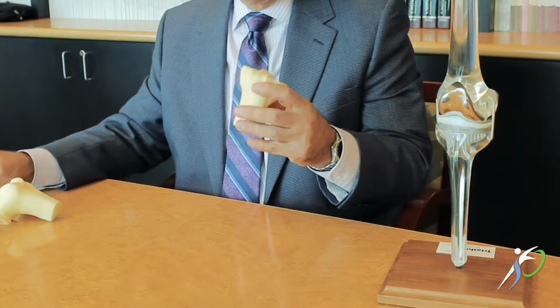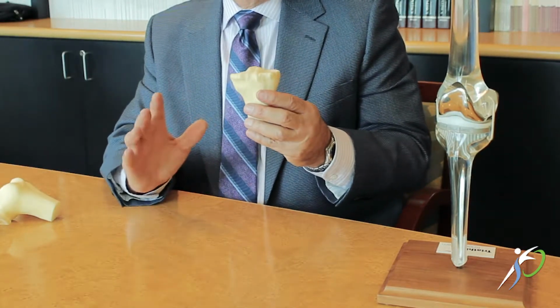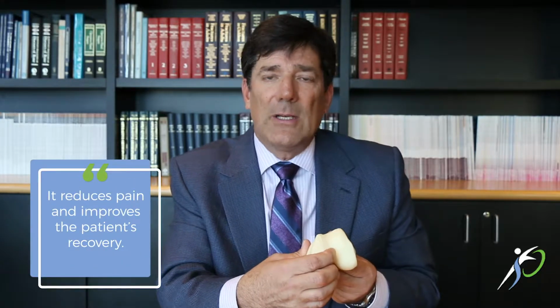By making these cuts very straight, it takes out all of the guesstimate that's done at the time of surgery when we do these manually, and the results are that the cuts are perfect. And in terms of the femur, we don't have to drill a hole in the bone to line up the bone, which we normally would do, and this reduces bleeding and reduces pain and improves the patient's recovery.